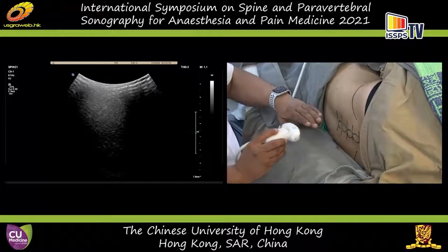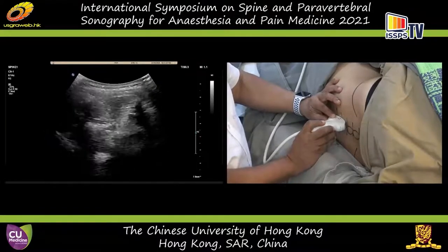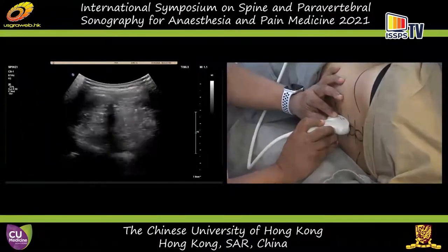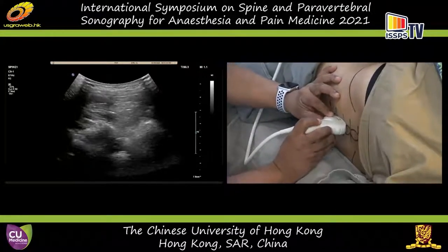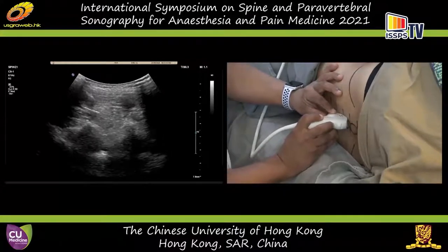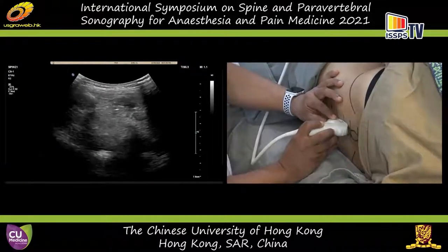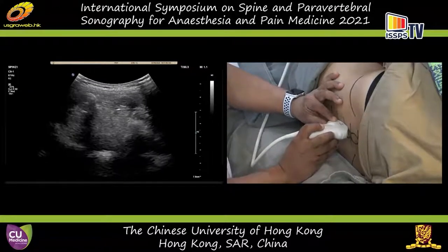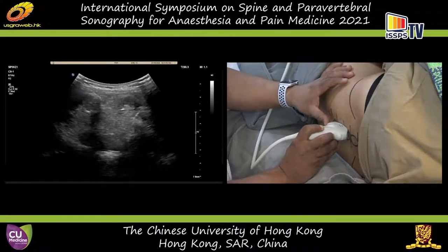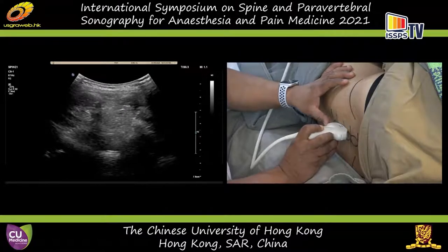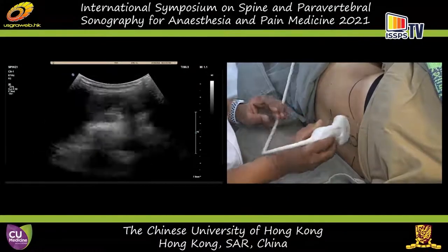You can do a midline median sagittal scan, but we try to avoid this because it's not very useful and sometimes very difficult to acquire — the spinous processes may not be aligned one over the other. Through the interspinous spaces you can see the posterior dura and the anterior complex with the thecal sac in between. The paramedian window is by far more commonly used.